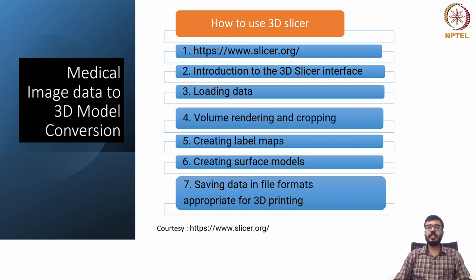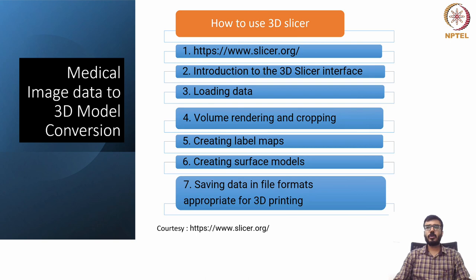First we will see the 3D Slicer interface, and then we will see how we can load the data into the 3D Slicer interface. Then we will go to the volume rendering and cropping section, and then we will see creating label maps. Later on, we will also see how we can convert this into surface models, and how these models can be converted to 3D printable formats. All these steps we will see in detail.